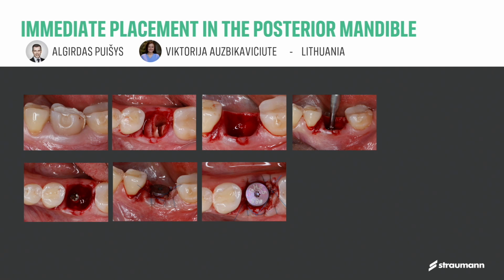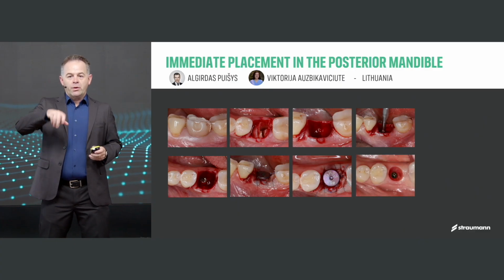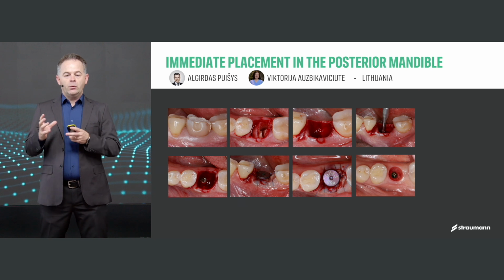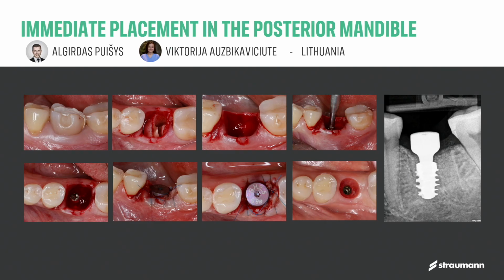You place a healing abutment, you make single sutures to bring the tissues closer to protect that wound. And as the healing goes by, when we remove the healing abutment, that's what we see. It's a very beautiful healing process. Here comes the interesting part, because as you notice, the healing abutment has this flaring following the emergence profile, but then it comes up very cylindrical.